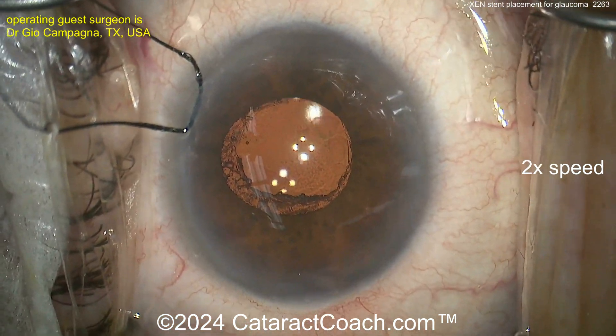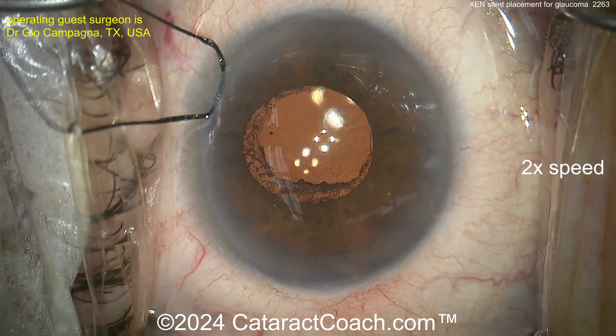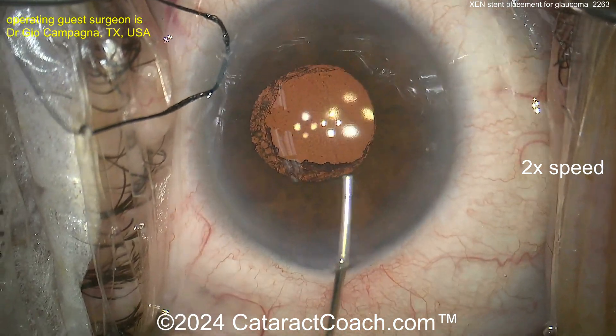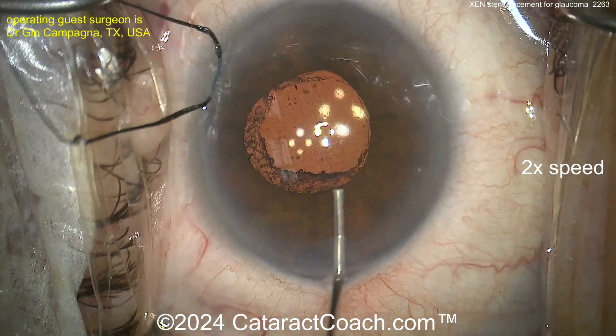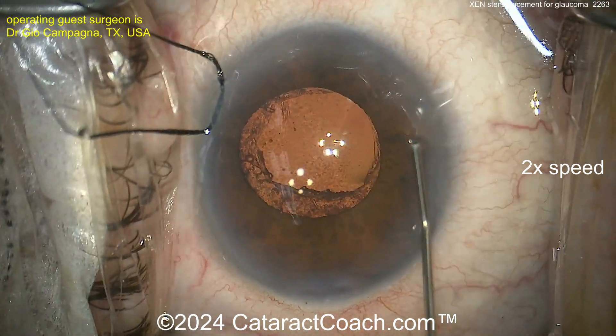At this point you need to prepare the conjunctival area and sweep the Tenon's out of the way, so that the distal tip of the Zen stent is clear — you don't want Tenon's blocking it. Ideal placement is just anterior to the trabecular meshwork; always use the gonio to confirm that.